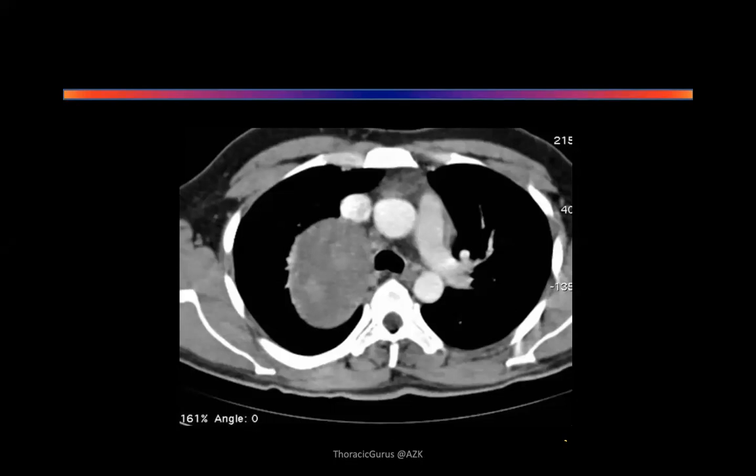Lymphadenopathy, I wouldn't jump on at the moment because you're not talking malignancy. You're still talking lots of benign things. Talk about surrounding structures. No pressure effects. Is there any pressure effect? It is slightly abutting on the carina, sir. Yeah, so it is close to the right main bronchus.